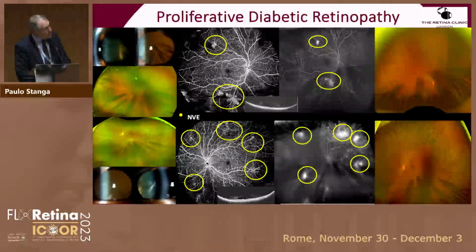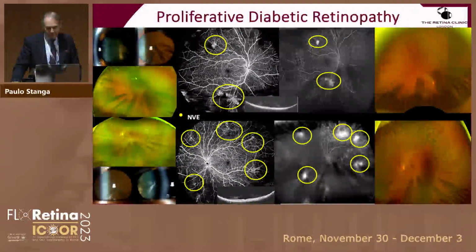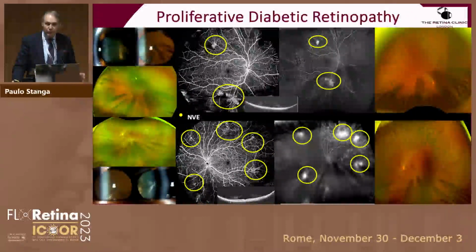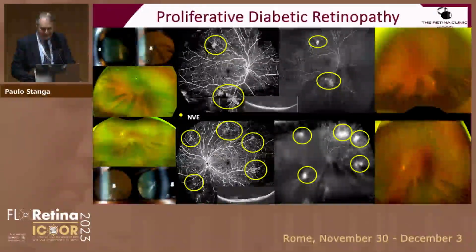This is the corresponding ultra-widefield fundus fluorescein angiogram, and this is the Intalight DREAM OCT, single scan OCT angiography of these diabetic patients. You can see how we can clearly see, much better than on the ultra-widefield fundus fluorescein angiogram, the areas of non-perfusion and the secondary neovascularization elsewhere. And this is straight after targeted retinal photocoagulation. So I wanted to finish with this case because I think it clearly shows the advantages of this technology.